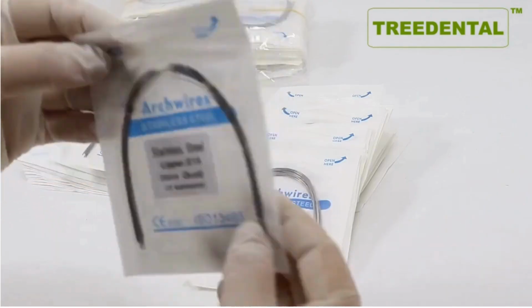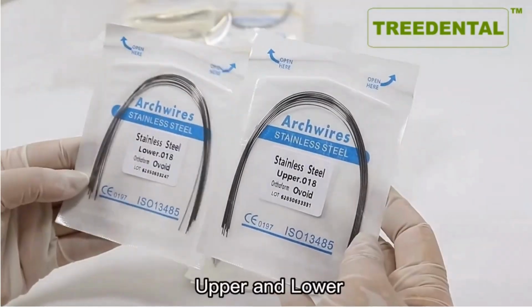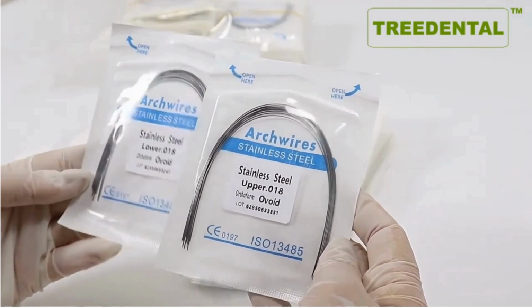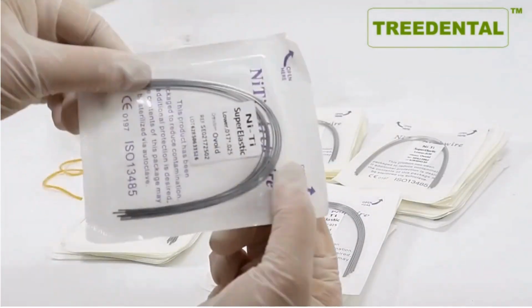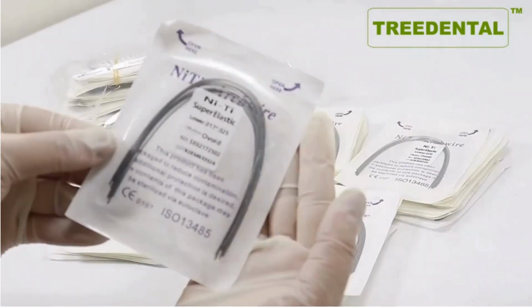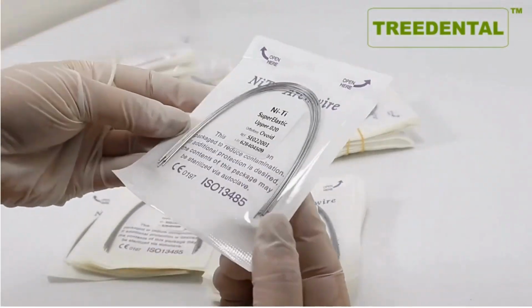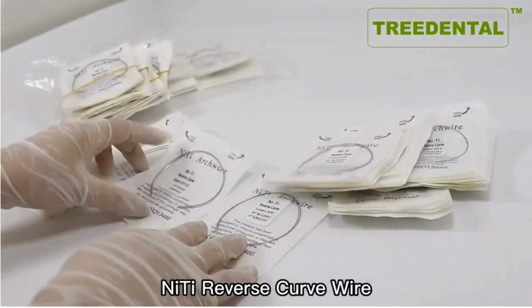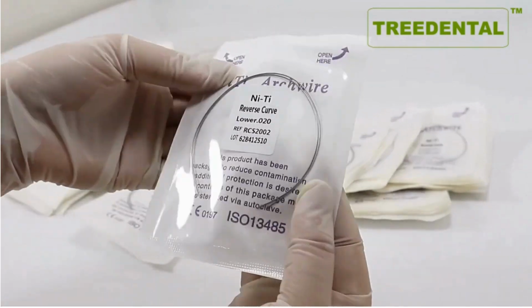In this video, we can see upper and lower arch stainless steel wire of ovoid shape and different sizes. These are nitinol wires of upper and lower arch which are superelastic in property and ovoid in shape. Nitinol reverse curve wire of upper and lower arch, which are used to treat deep bite patients.